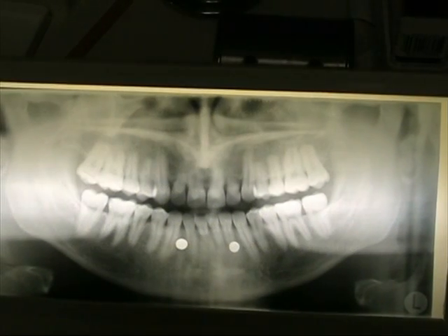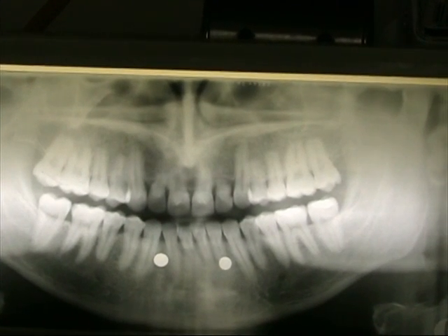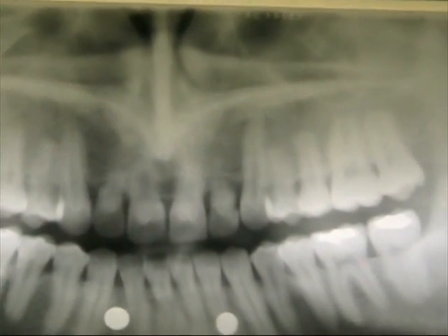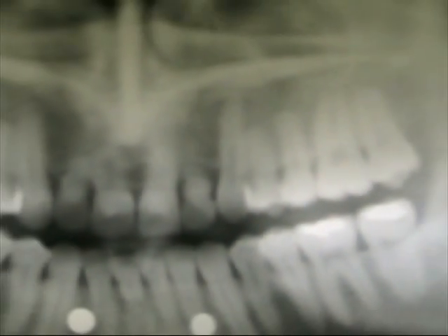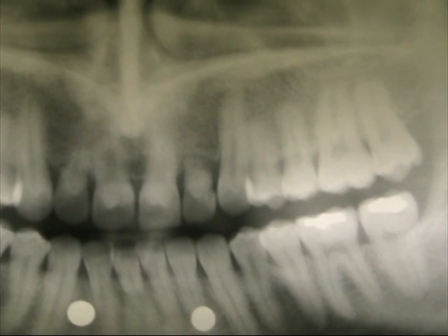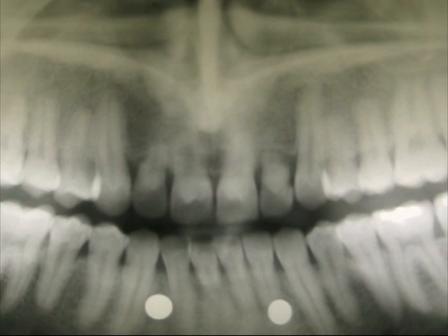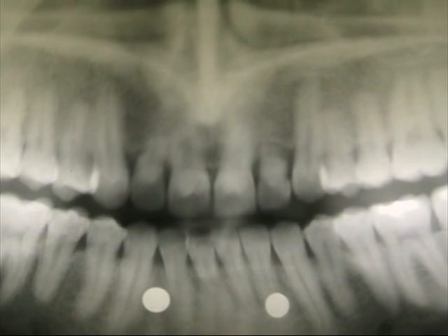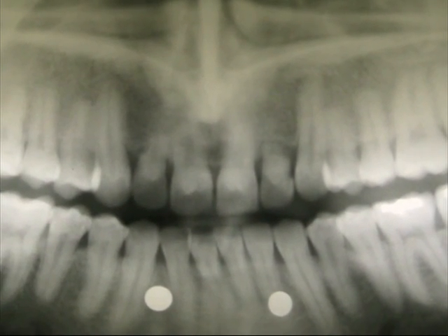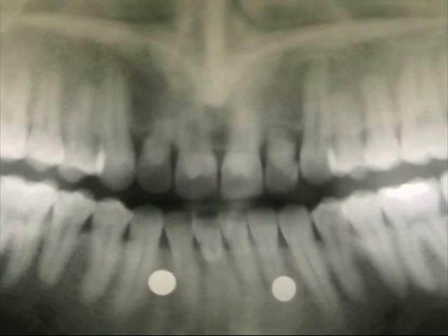Today we're going to extract tooth 2-2, which has become mobile after root resorption post-ortho. The bone recession or bone loss is both vertical as well as from the facial buccal area, and that's where we'll need to graft. We have lost the facial plate — these cases tend to be a little bit more difficult in terms of providing long-term aesthetics and not making the root look too long.